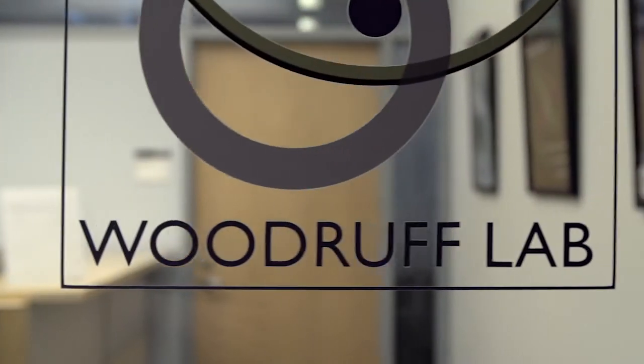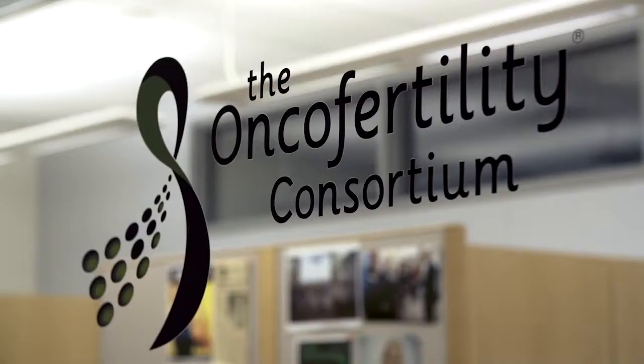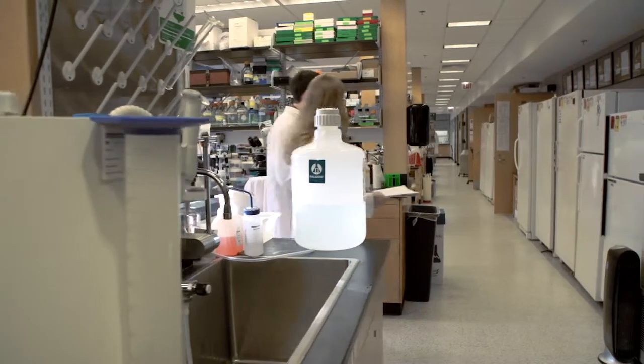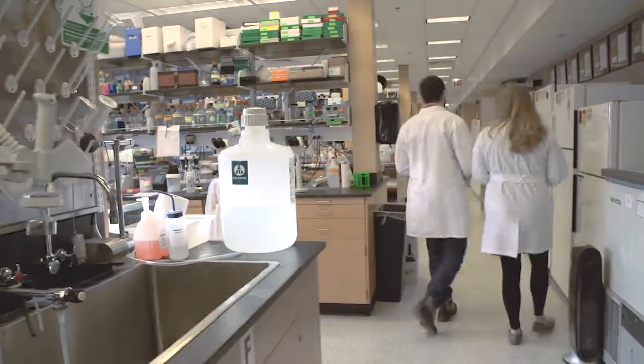This video will go through the basic technique for ovarian dissection in preparation for ovarian tissue cryopreservation. There may be a situation where you only receive a portion of one ovary. If that is the case, the dissection may be very different than if you are dissecting a whole ovary.